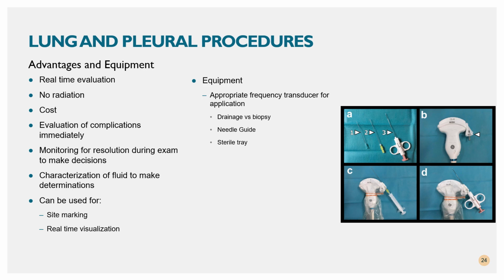So one of the main things that ultrasound is used for is site marking. Lots of times physicians will do a thoracentesis or a paracentesis. They're not doing it under ultrasound guidance the whole time, but what they'll do is find their largest pocket, make sure that they're away from, say, the pleura, evaluate the depth that they want to progress to, and do some of those things. So lots of times they're just using this to mark their site and take that information, and then they no longer use ultrasound until maybe after the completion or at the end of the procedure.